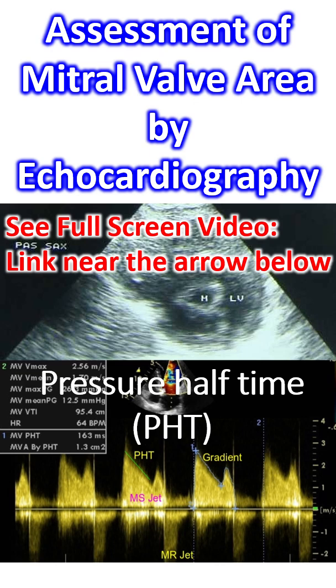In this image, the green cursor measures the pressure half-time of the mitral stenosis jet. In this case, the pressure half-time was 163 ms.